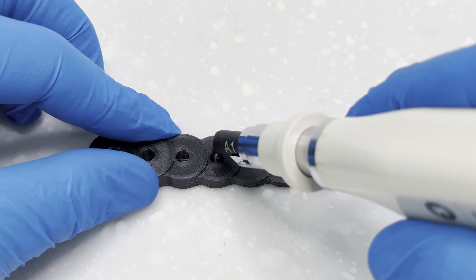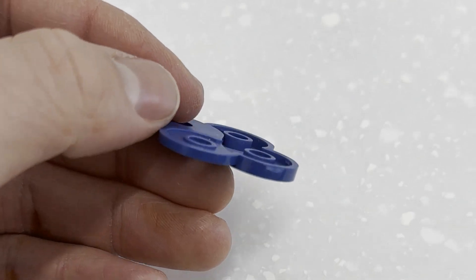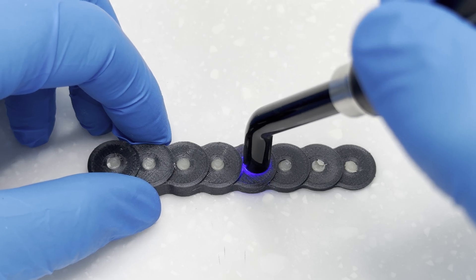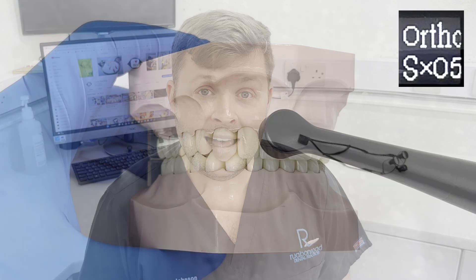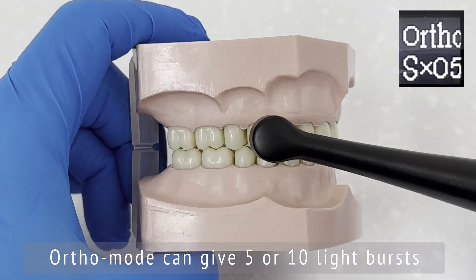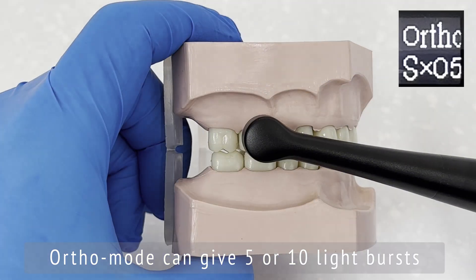I had an idea about 3D printing a custom gauge to test how far different lights could cure, using the composite depth gauge included with the Ostar accessories, but decided it wasn't a fair comparison — and you'd rarely cure layers more than four millimetres anyway due to the C-factor. Moving on, this light also features an orthodontic mode, available in either five or ten consecutive light bursts, presumably to secure brackets or attachments more efficiently. The intensity of ortho mode is comparable to turbo mode.